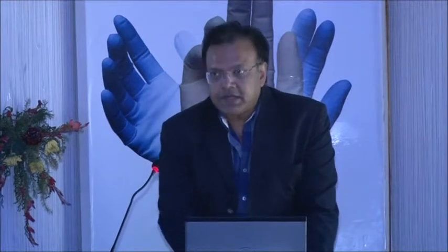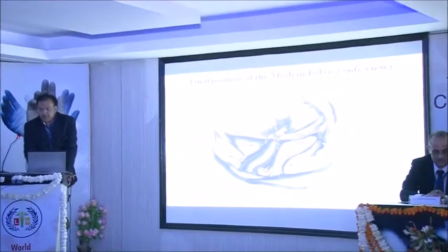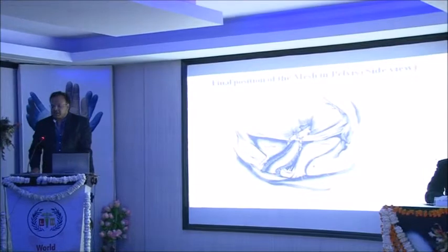This is the final position of the mesh. This is the bladder. After dissecting the bladder down, the anterior vaginal wall is exposed. Similarly, you have to push the rectum down, so the posterior vaginal wall is also exposed. You have to take a T-shaped mesh — fix one arm over the anterior vaginal wall, one arm on the posterior vaginal wall, and the tail to the sacral promontory. This is the lateral picture. This is one arm, two arm, and the third arm — you can call it a T-shaped mesh or Y-shaped mesh.